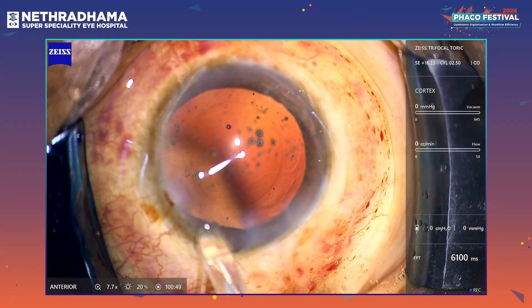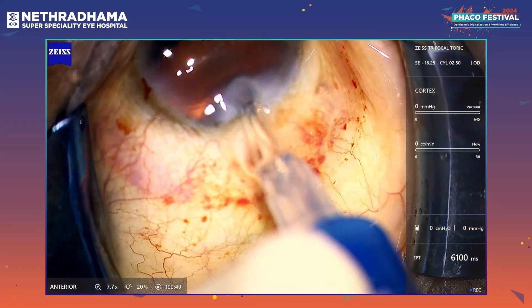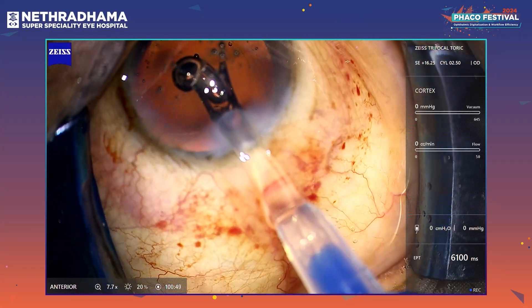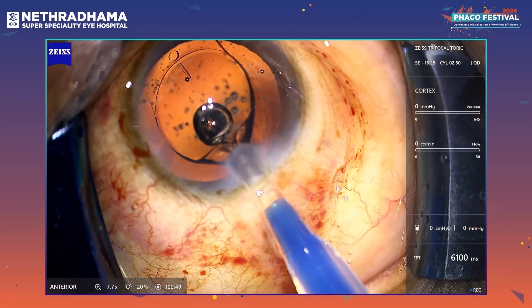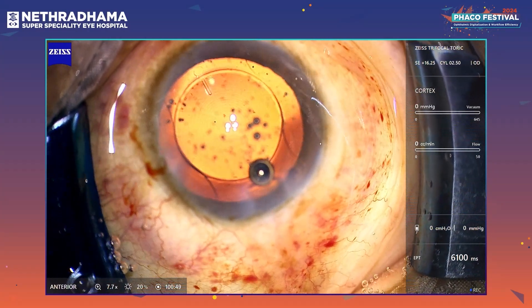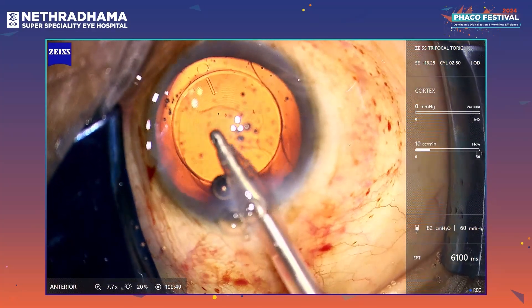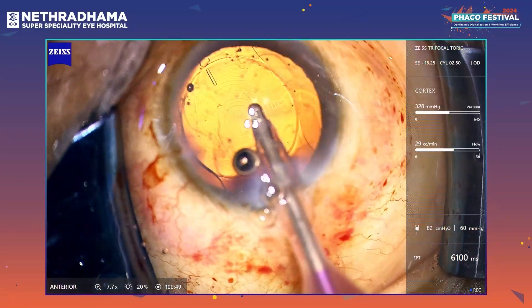The incision size is 2.4 — it's a 2.2 tip, but I'm more comfortable with a 2.4 incision. It does not make any difference to the leak or chamber stability, but it gives a little more room for smooth IOL injection. This lens gives you great vision for distance, intermediate, and near. The intermediate is at around 70 cm for this lens.